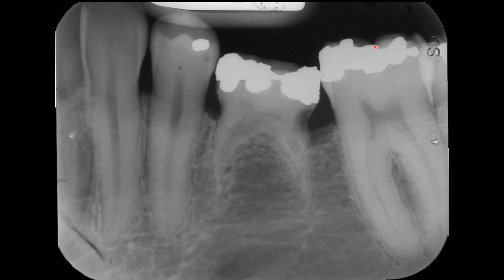Compared to the occlusal surfaces of the first molar and first premolar, we consider the deciduous molar as submerged. Further, we see a carious lesion on the distal surface.